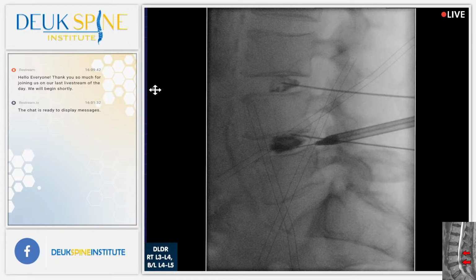All right, so you can see from the dilator, Jordan, go ahead and point it out. The tip of the dilator is low within the foramen, right at the back of the herniation. And that's why she's uncomfortable. She's feeling the tip of this dilator pushing on her painful disc herniation.